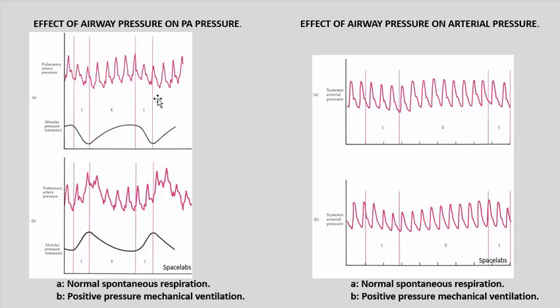The purists used to say that we should measure intracardiac pressures at the end of exhalation at this point. And they used to say we should ignore the top point and measure the average of the immediately preceding 2 points. That's all right if you happen to have long enough breaths where you record several beats in between. Very often, you might only have 1 or 2 or 3 beats between the bottom point and the top point. The reason for this is that at the end of exhalation is where you negate the effects of atmospheric pressure, and therefore you're recording a true physiological value uninfluenced by external factors such as atmospheric pressure.